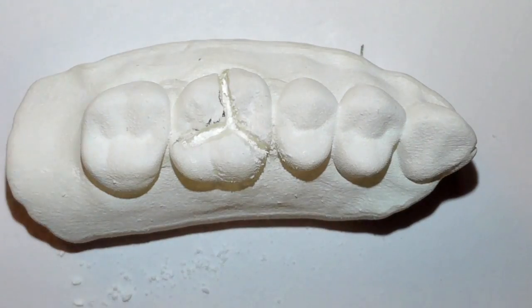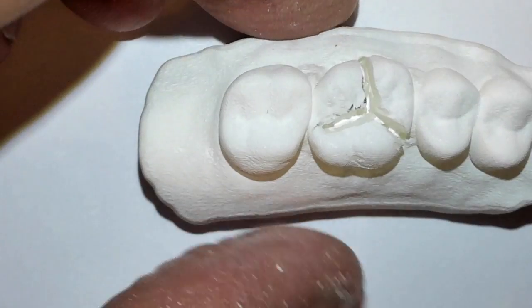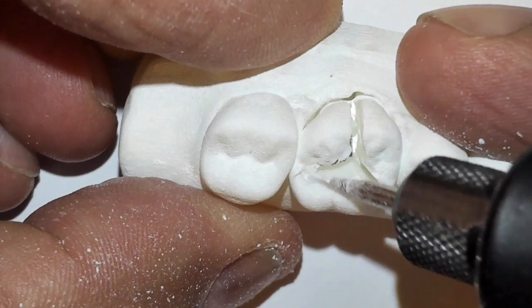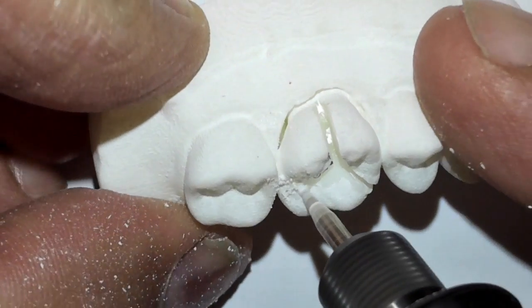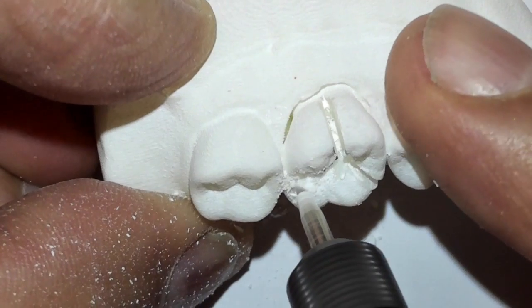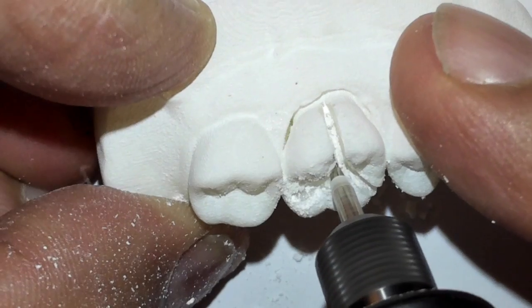With that would be a 556. So you can go back and forth with that. There's my peace sign. I know that the furcation on the distal is toward the lingual — not straight in. So remember that when you're doing your cut on the distal aspect. Now I'm cutting it and I feel really good; it's getting nice and deep.